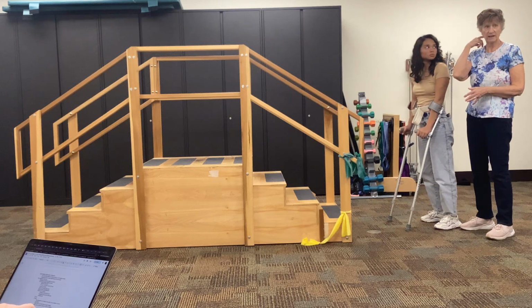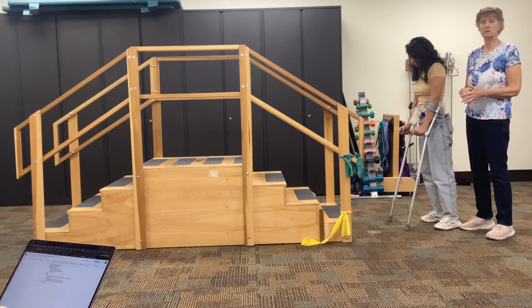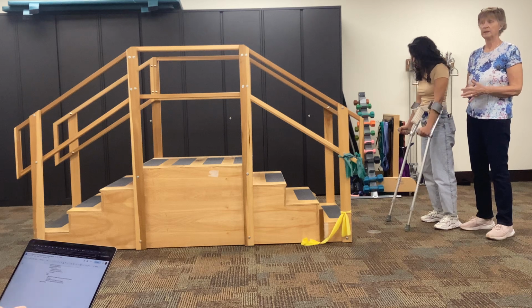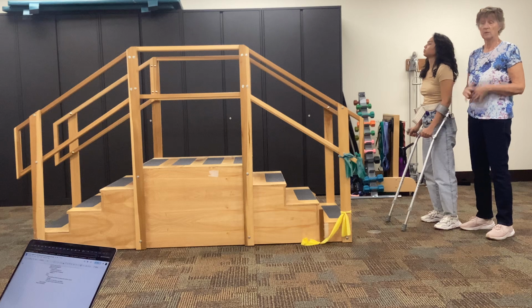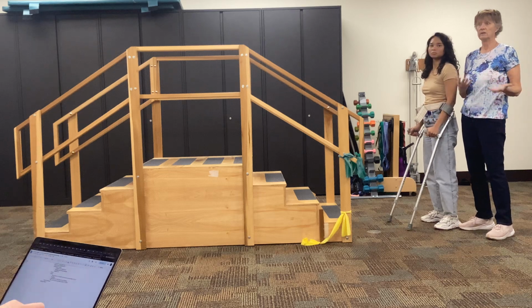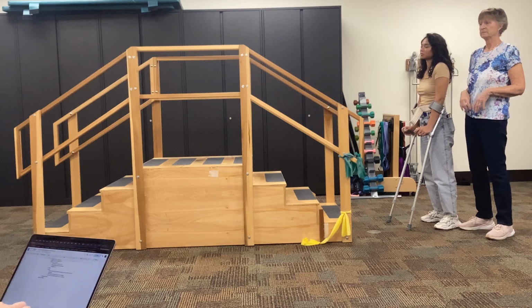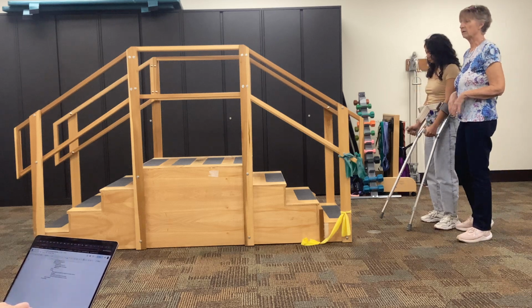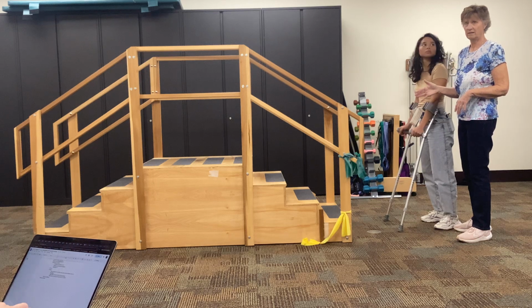Again, it's one of those aha moments when you have a real patient who is paralyzed, but this is the gait that you're going to teach them. Or they may come to you and already use it and had a different issue go on. Okay, so the stairs are harder, okay, because she has to do the same thing.